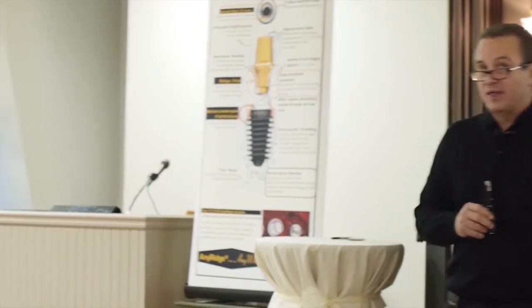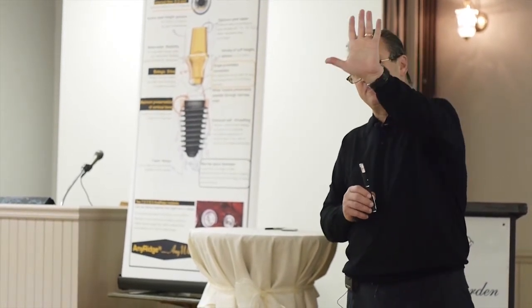Blue Sky Bio has the same thing. It's a drill that they use in neurosurgery to go through the cranium, and when it's drilling, the particles go in front of the bit so that you wind up not perforating the meninges, or in our case, the antral membrane. And I've had good luck using those things. I really like them. You familiar with that too? It's kind of the safest thing to do is to use those burrs.